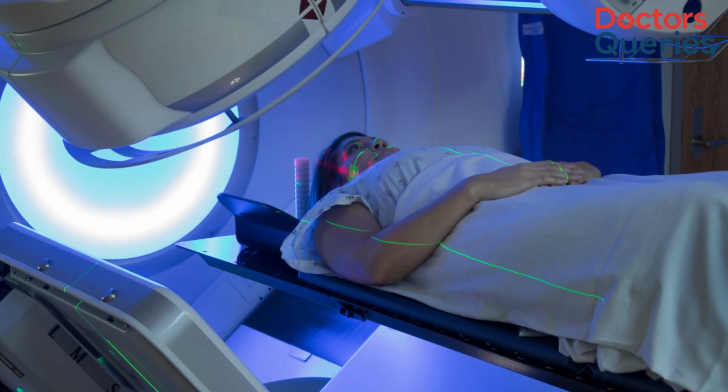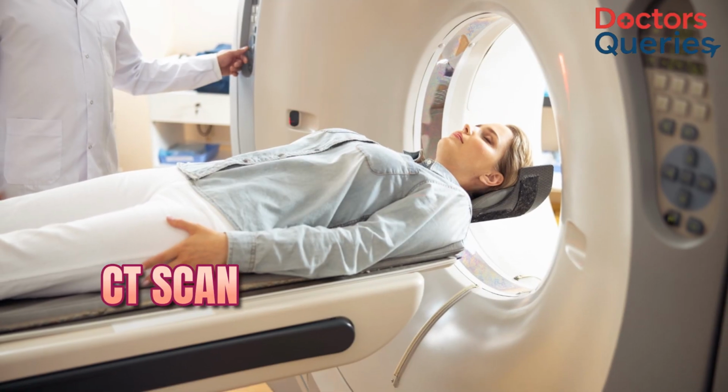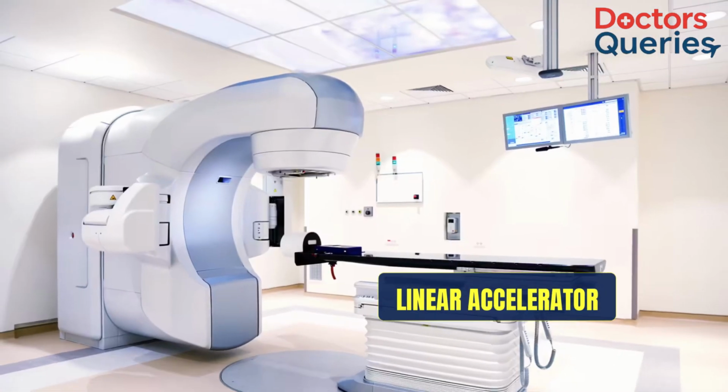These are the same rays which are used to diagnose, used in the CT scans. The same X-rays are used to treat cancer. These are slightly higher voltage X-rays. Now, these X-rays are used to treat cancer with the help of a machine called a linear accelerator.